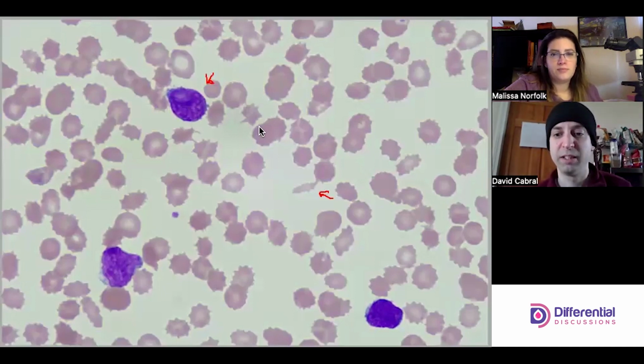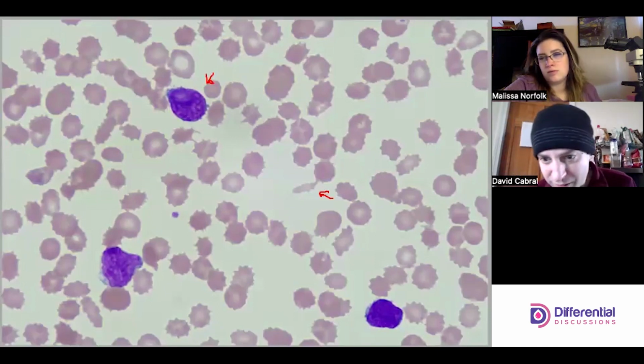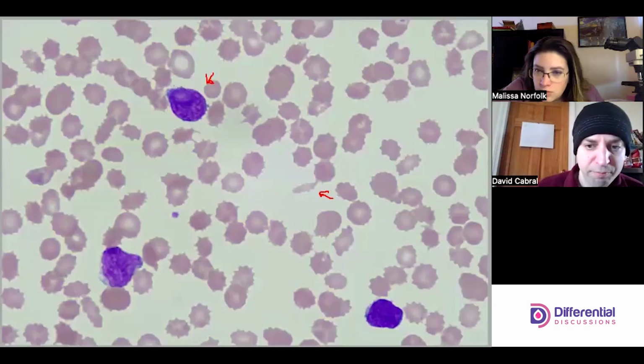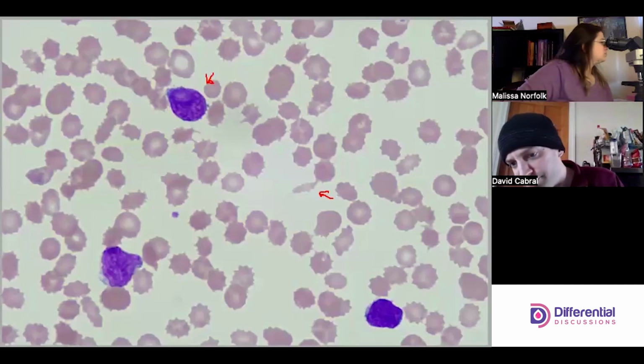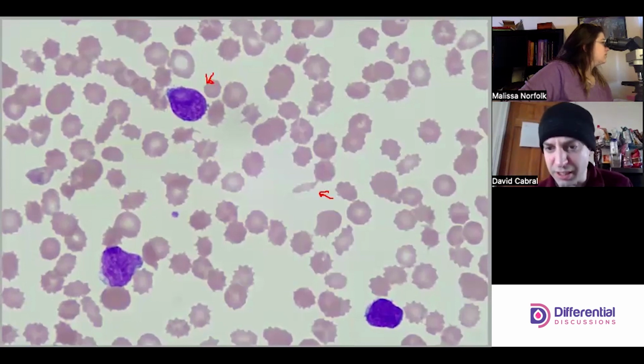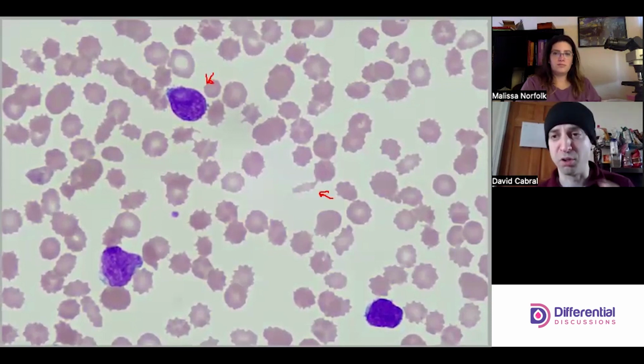And then bottom right, darker and everything. I don't know. I get an itchy blast finger right now. It's kind of tough to see detail, but I think I kind of get into a mode where if you're a normal lymph, you better prove it to me at this point.